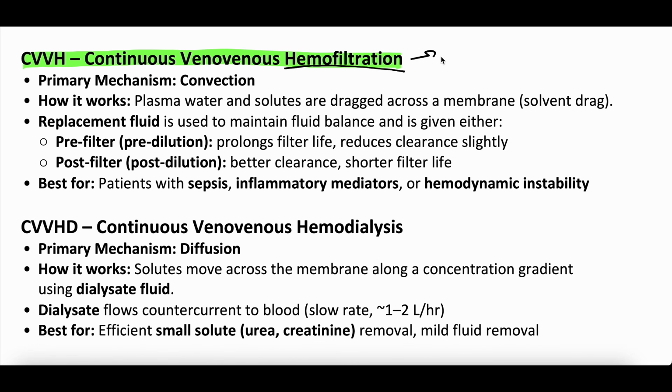And hemofiltration, we said, anytime we see filtration, we should correlate it with convection. So the primary mechanism of CVVH is convection. That's how it gets rid of solute. So there's no dialysate. This is convection.